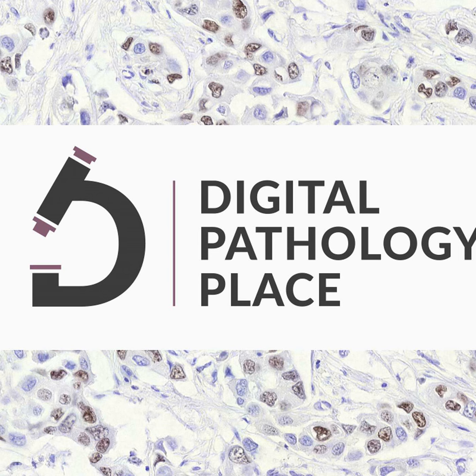I'm like, okay. And remember when at the beginning we said that a model like this is supposed to have over 300 million parameters? Here we have 132 million parameters, trained with this DINOv2 framework. DINO is another acronym of theirs, but basically it means a lot of data. This is what those foundation models are. They are huge. ChatGPT and those language models are foundation models. They can talk to you, right? They were trained on massive amounts of data, and now you can ask them questions. And there are groups trying to do that in pathology as well.